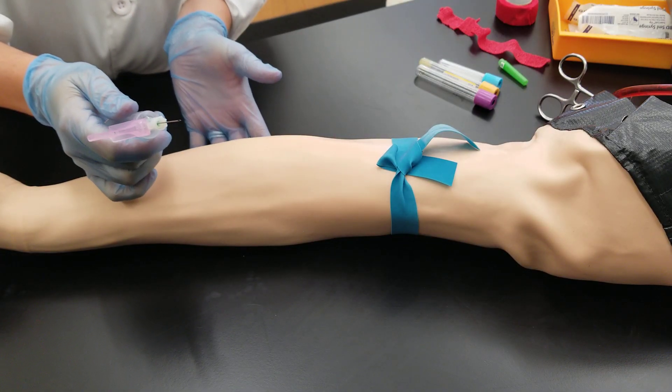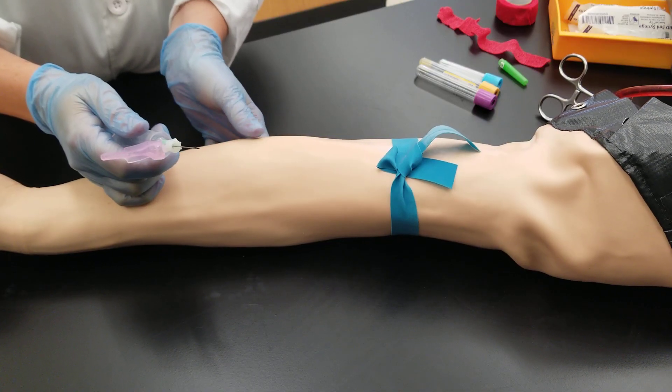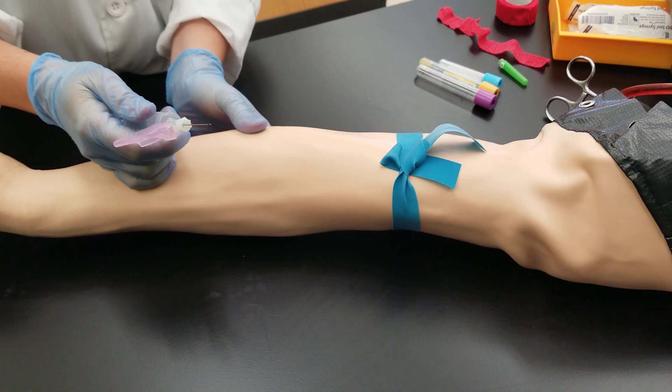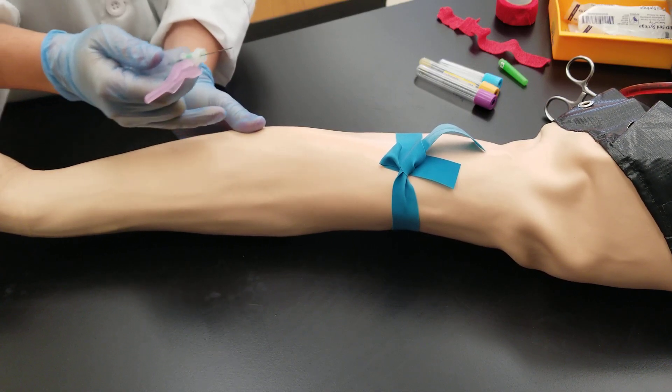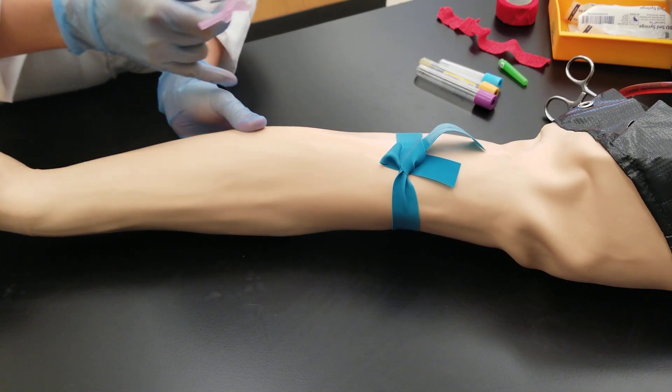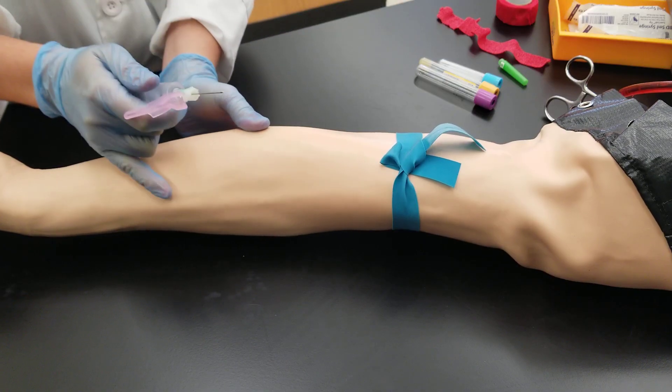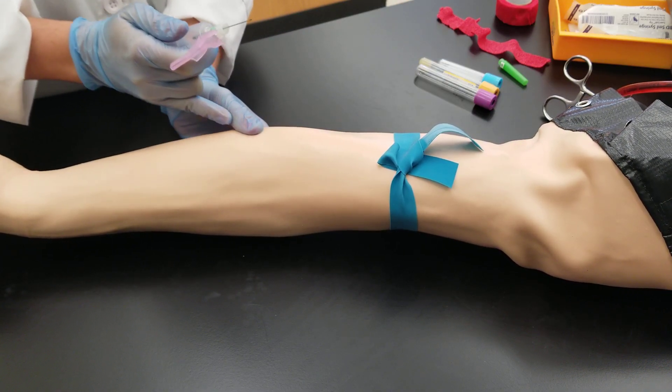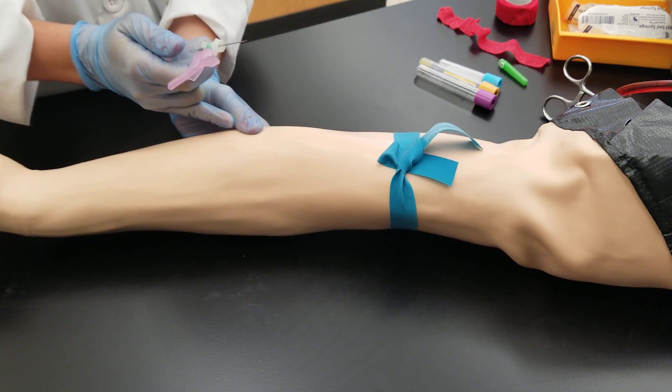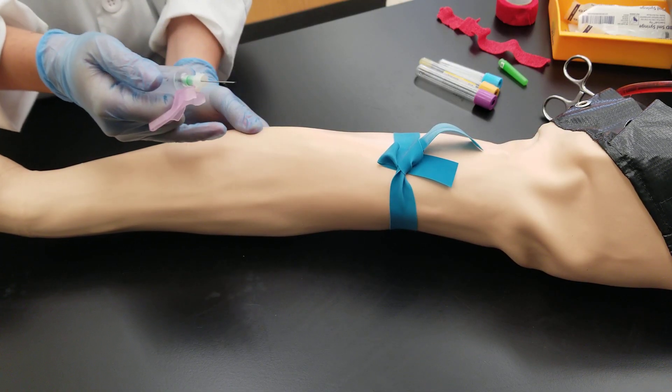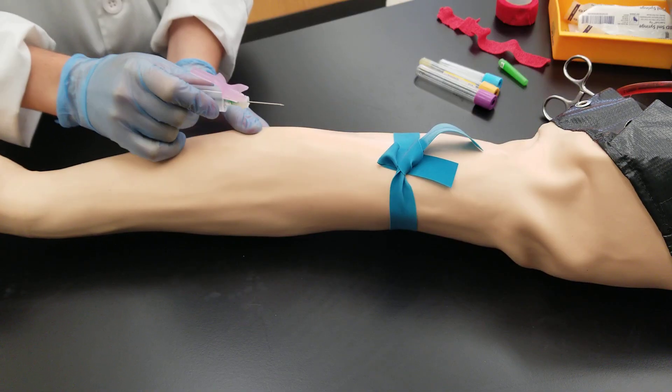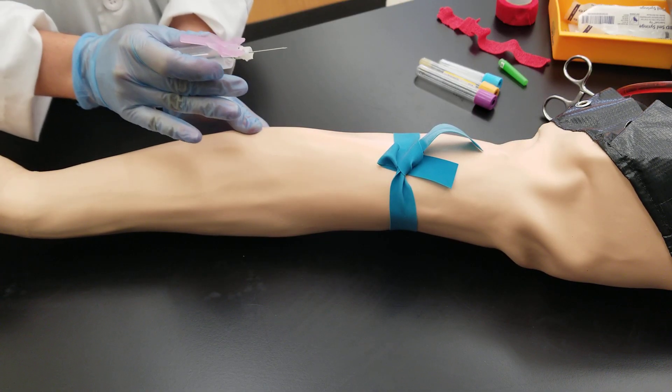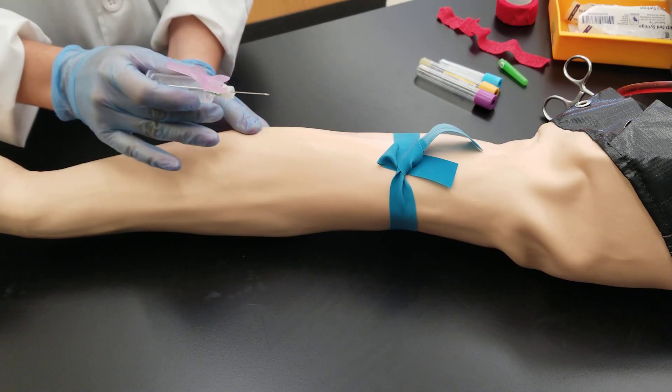So what I'm going to do is I'm going to use my left hand, which is not the hand I'm going to be drawing with. I'm putting it around the patient's arm and I'm pulling down on the skin with my left thumb. And that is to make sure that the skin is taut. And it also helps to anchor the vein in order to draw from it and it not roll.